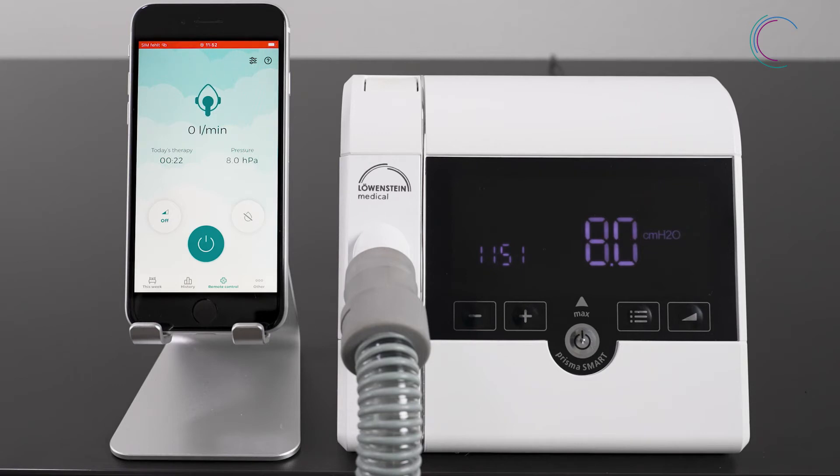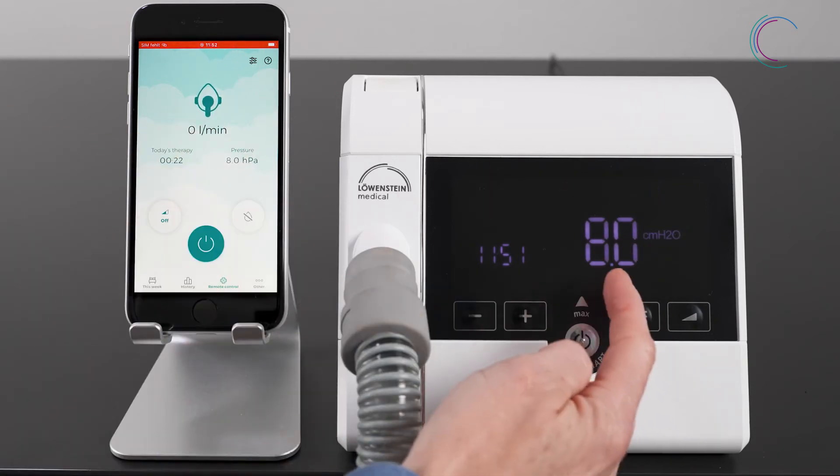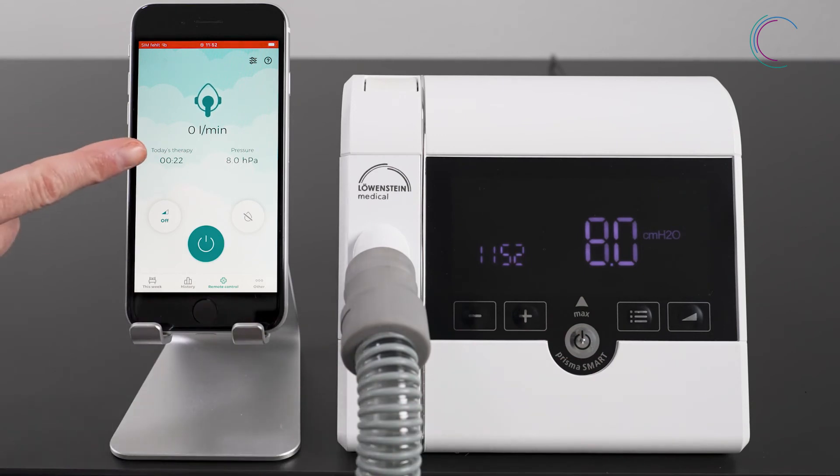You can see the current therapy pressure, the therapy duration, and the mask fit, also known as the leakage display.